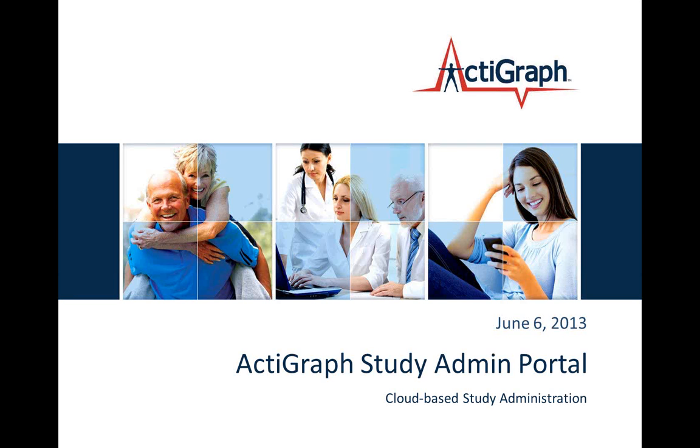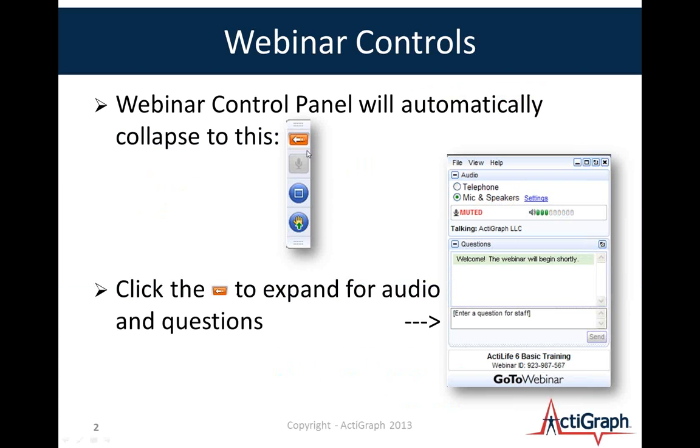We did have a good webinar this morning on the same topic, and we're going to cover the same material, so if you were with us this morning, you'll hear some of the same content. If you have questions, we can entertain them in the middle or just wait till the end, maybe better. But today we're going to be talking about the ActiGraph Study Admin Portal. I'm going to go ahead and get started here.